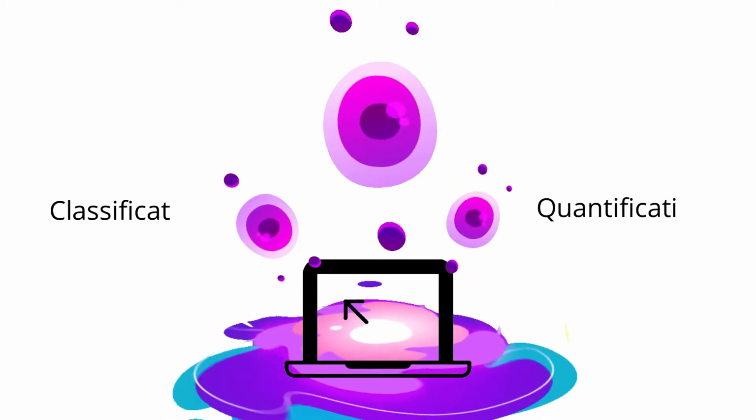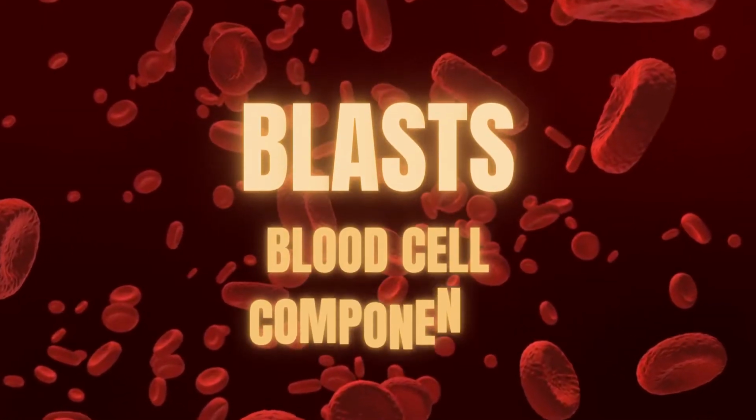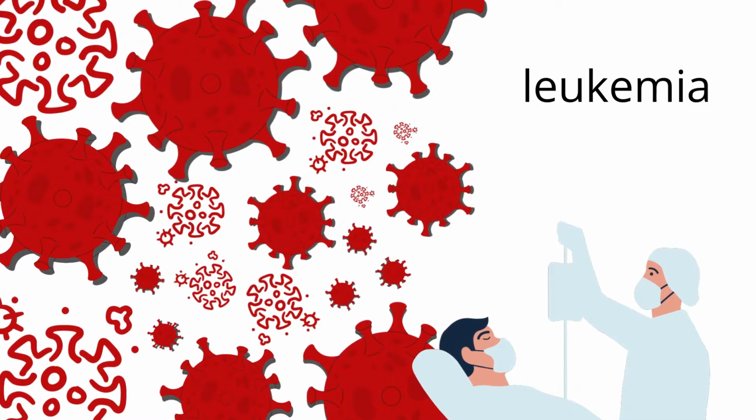Hello guys, we are Automates, and this is the demonstration for our software, DETECH, a desktop application that automates the classification and quantification of blasts and blood cell components to predict the possible presence of leukemia.